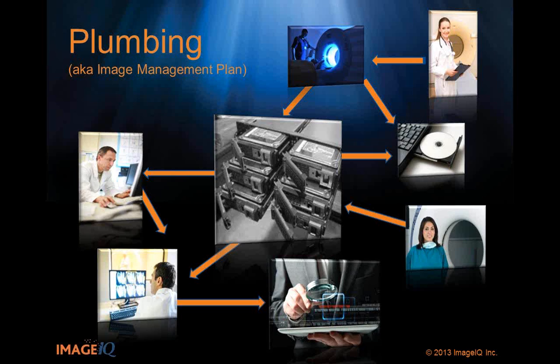How many times have we seen that the site goes to the real trouble of anonymizing the patient images, and then burns them to a CD and writes the patient name on it? That's what they always do. They write the patient name on the CD. So that's an important part of something that can go in your protocol.